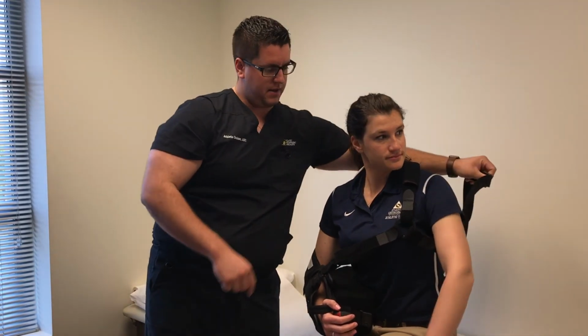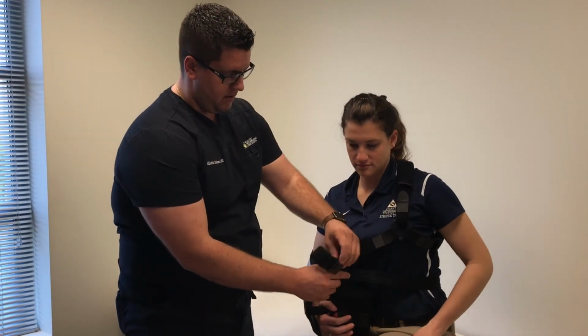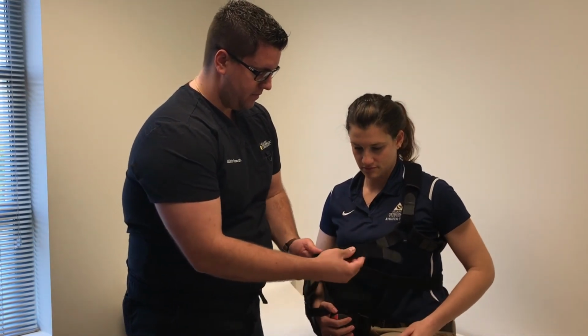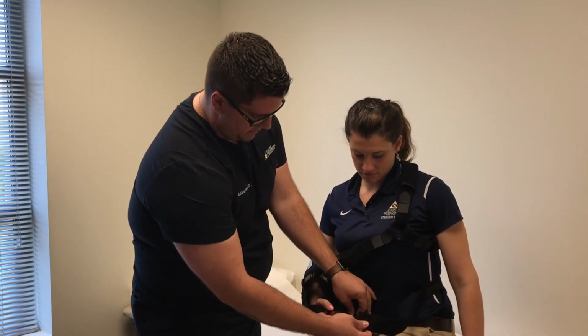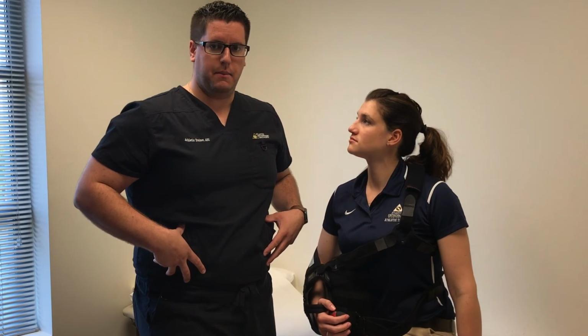That just comes around the side. Christine, if you don't mind, hand that to me. And this can also be adjusted just like the other straps. Pulling it tight as needed. And you just clip it in here to the front, just like that. So that helps to hold the pillow in place as well.